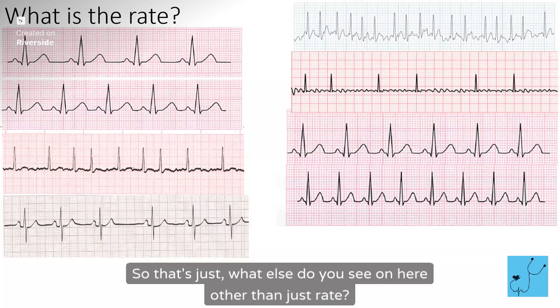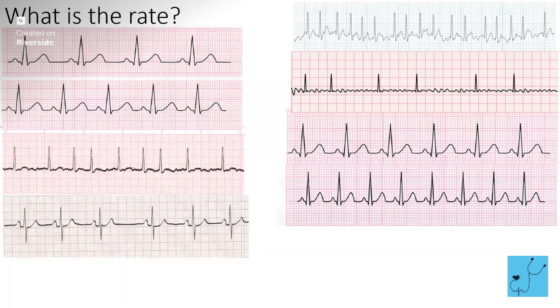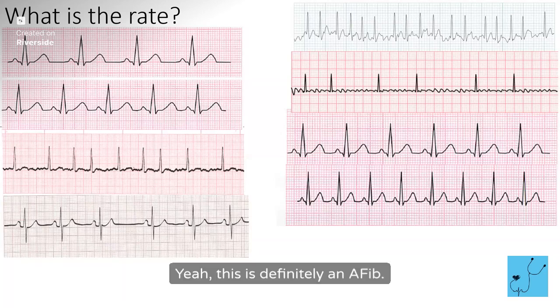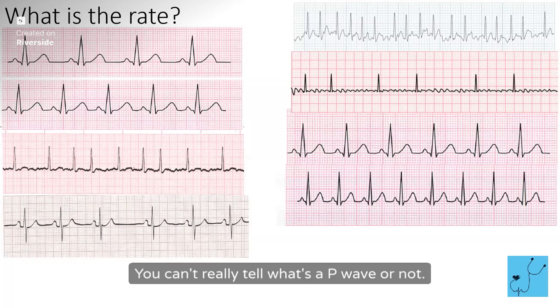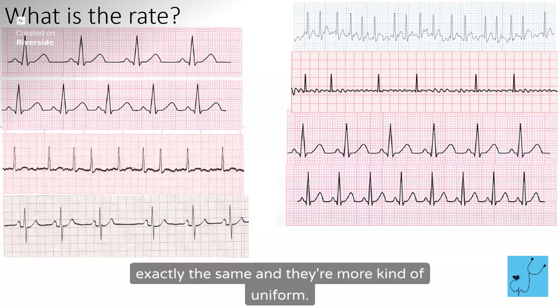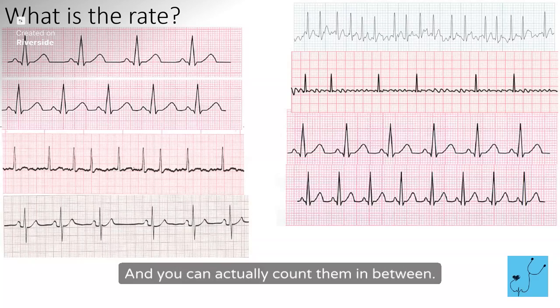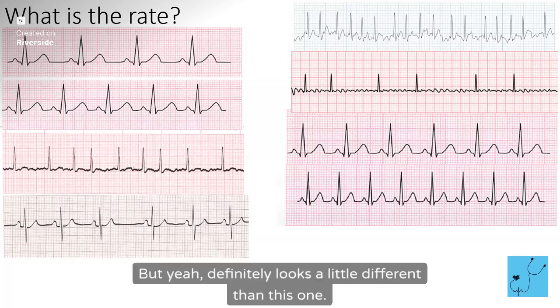Okay, what else do you see on here other than just rate? Is there any other rhythm that sticks out as something different? Yeah, this is definitely an AFib. So it's irregular, and then you just have these little wiggles in between. You can't really tell what's a P wave or not. What about this one? It looks like a flutter, right? Flutter waves. Now it can go either way because usually with a flutter, all the P waves look exactly the same and they're more uniform and you can actually count them in between. But these do look a lot like flutter waves. So maybe it's an AFib trying to go into a flutter or vice versa. But definitely it looks a little different than this one.